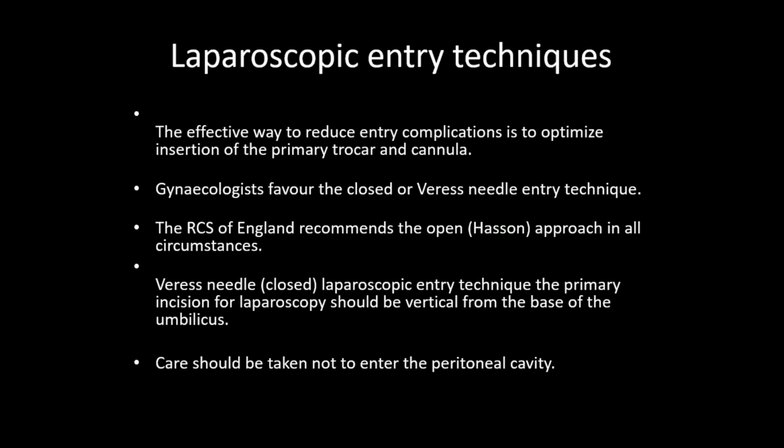The primary port, which carries the camera, is taking a look inside, then prior to inserting the secondary port, it should be visualized using this camera.